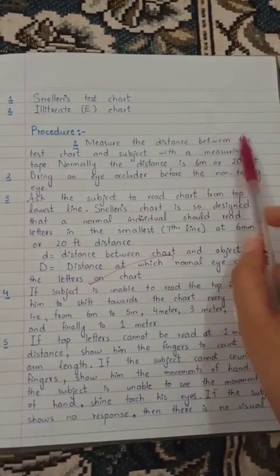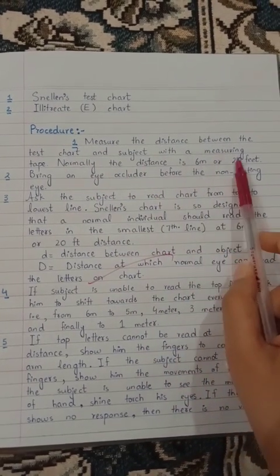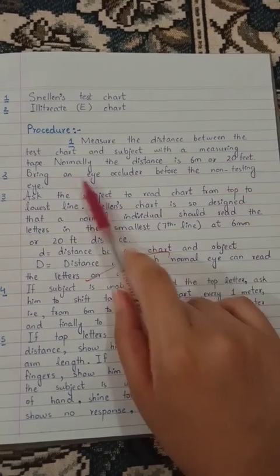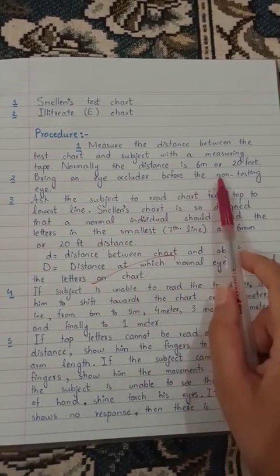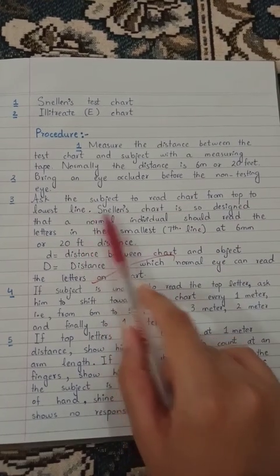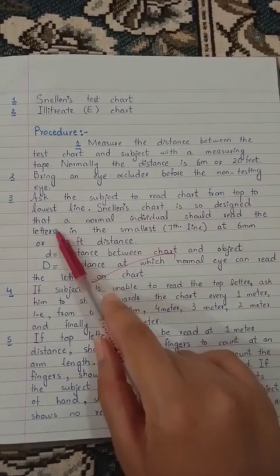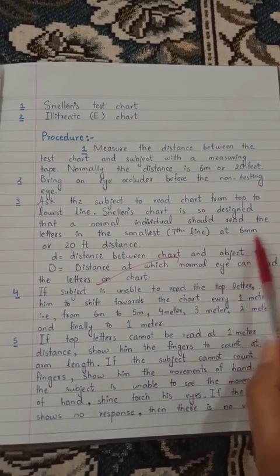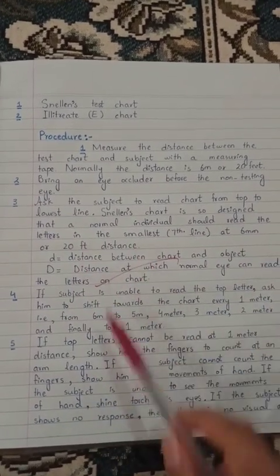Procedure: measure the distance between the test chart and subject with a measuring tape. Normally the subject is at 6 meter or 20 feet. Bring an eye occluder before the non-testing eye. Ask the subject to read the chart from the top to the lowest lines. Snellen's chart is so designed that a normal individual should read the letters in the smallest 7th line at 6 meter or 20 feet distance.